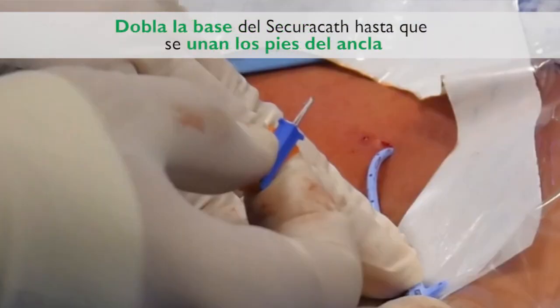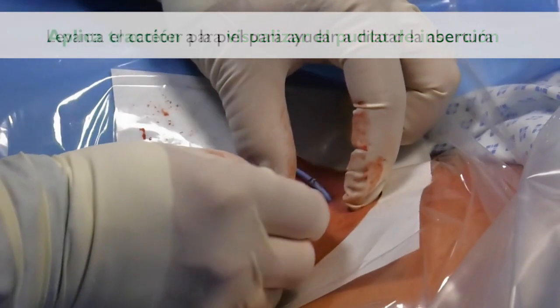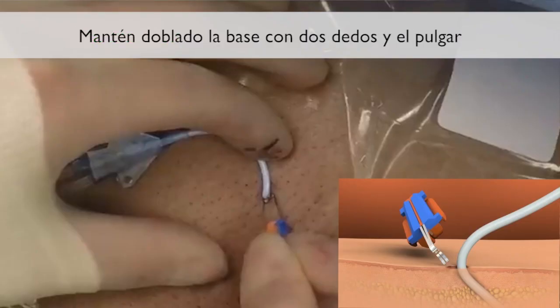Fold the SecuraCath base until the feet come together. Lift the catheter to visualize the insertion site. Apply traction to the skin to help dilate the opening. Grip the folded base with 2 fingers and a thumb.